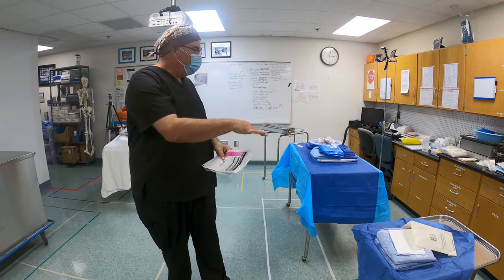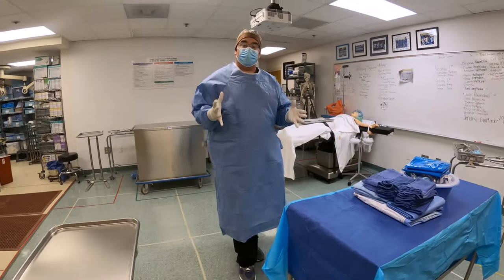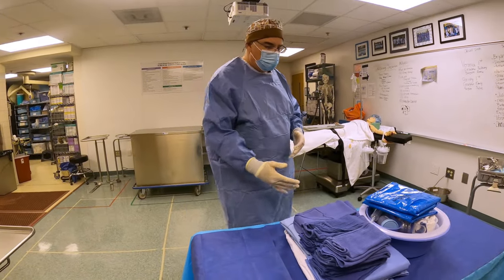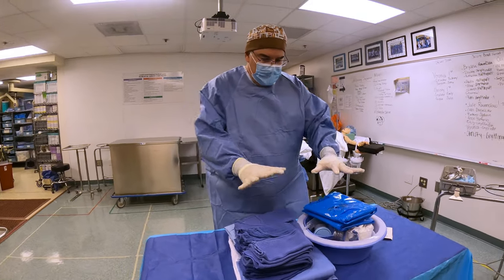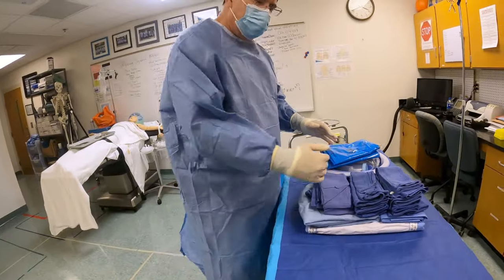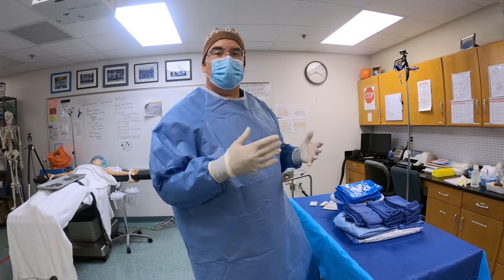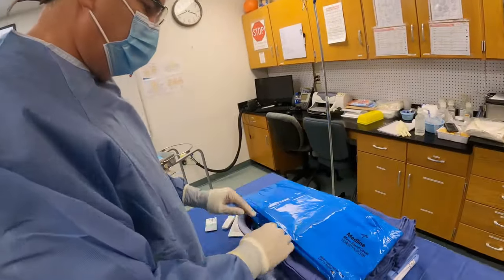At this point I have everything open and it's time for me to go scrub in. I've got my gown and gloves on and I have turned — make sure that you turn because if you don't, that can cause you a whole lot of problems later. Now that I am completely sterile, I can come right up to my back table. It's okay to stand this close; I don't have to worry about keeping that 12 to 18 inch distance. First thing I like to do is expand my field as much as I can so I have lots of room to work on, and that means the very first thing is draping my mayo stand.